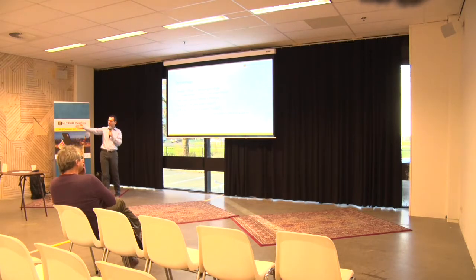So if I know someone, let's say Brad here, it's one thing if I just say hi, and it's another if I say hi, Brad. Because hi, Brad means I know you. And then if you respond saying hi, Mohannad, that's basically the handshake. We establish the handshake. It's the same thing with DICOM devices.